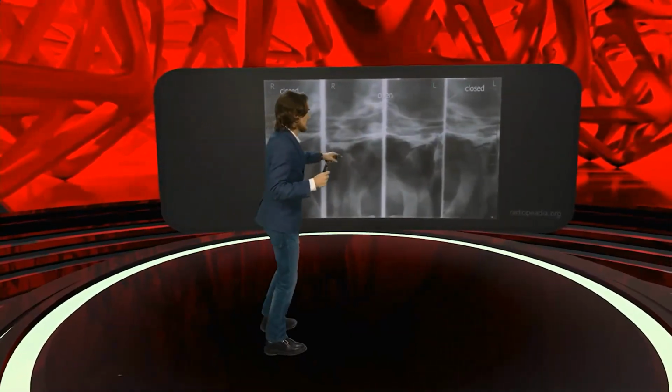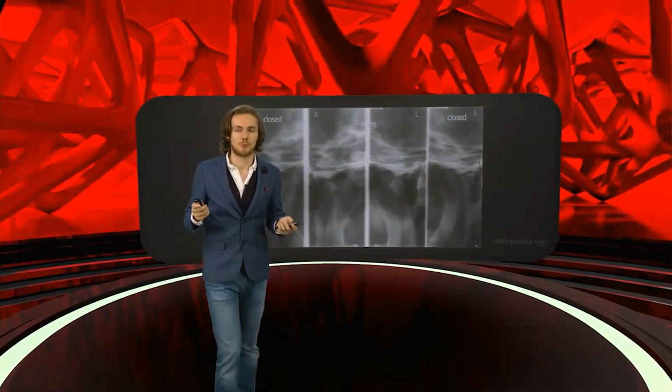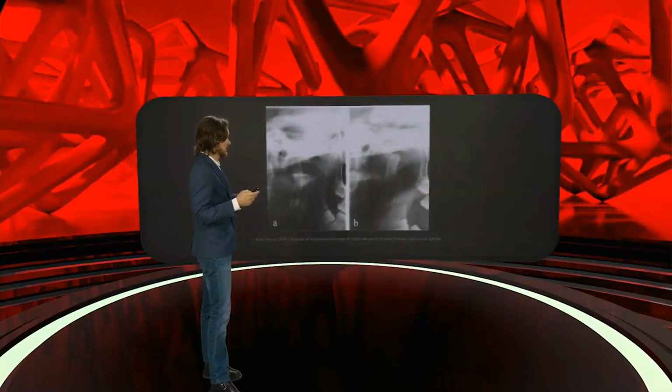So it goes too much forward. Of course, when we got a big pathology, you will see a little bit more. Like in here, you see the osteophyte. You see that the bone morphology is a little bit changed, but it must be a big deviation from normality if you want to diagnose something in here.